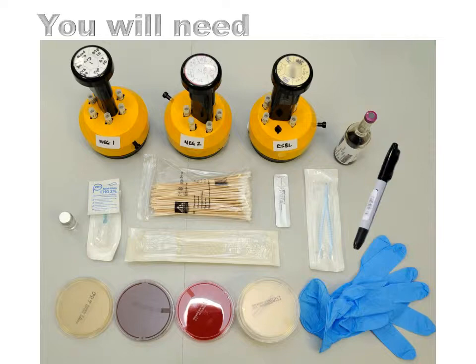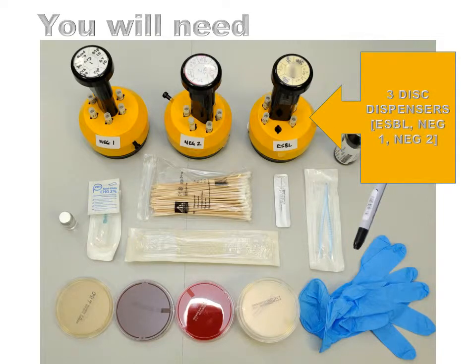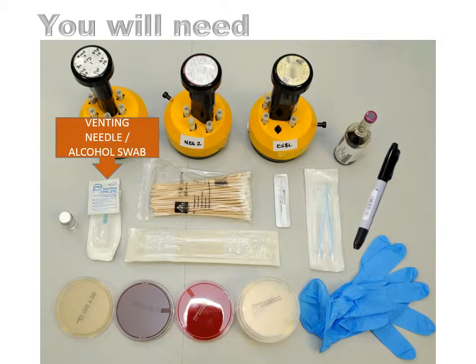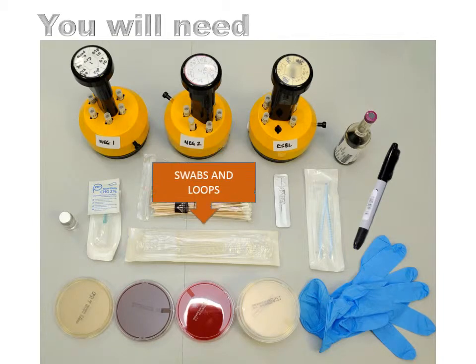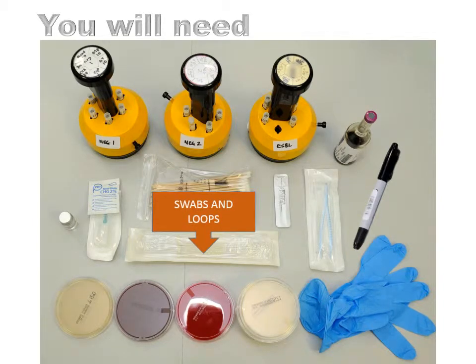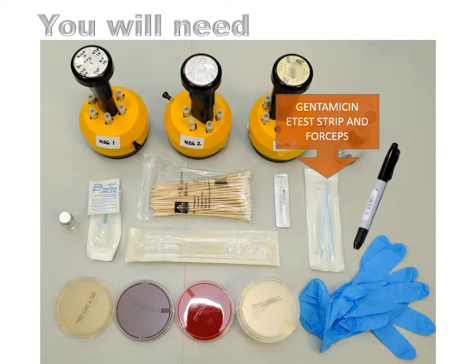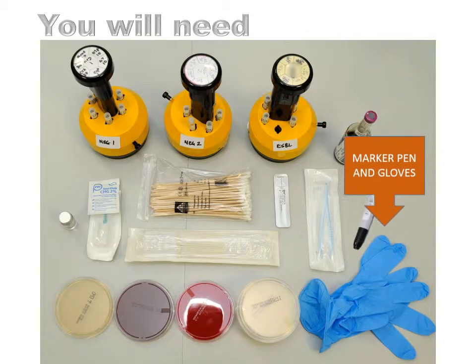In order to perform the test you will need the following equipment: three disc dispensers marked ESBL, NEG1 and NEG2; a bijou of sterile saline; a venting needle with alcohol swab; swabs and loops; a gentamicin e-test strip and forceps; a marker pen and gloves.